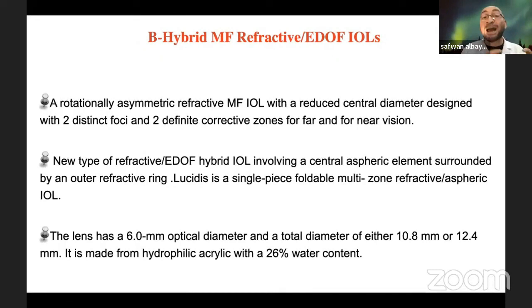Now, what's the hybrid refractive? The refractive is a refractive plate, as Khalid said, and in the center, they reduce the power of the refractive plate by 1.5 diopter, and they add a negative spherical aberration in a way that can reduce the post-op dysphotopsia.